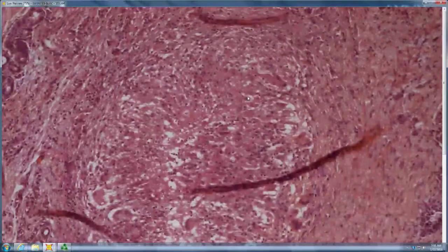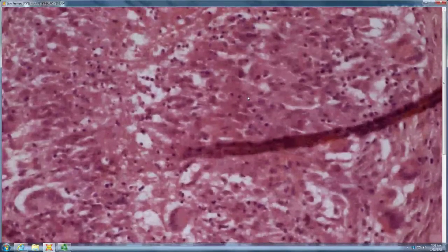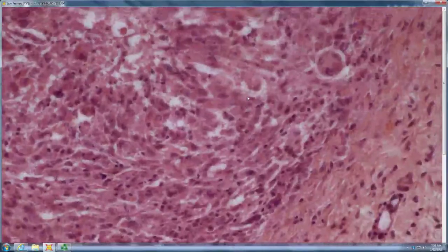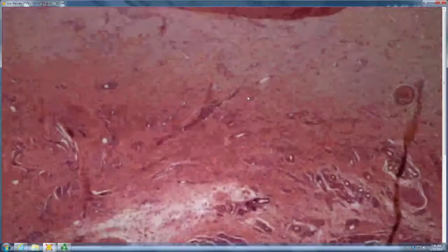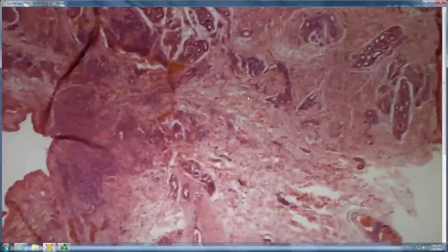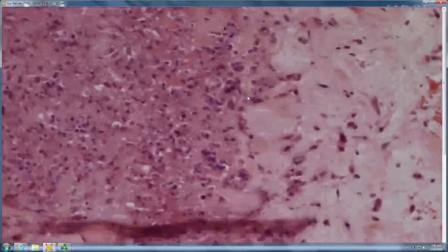Okay. So there are several giant cells down there. And let's see if we can find. You always look at an abscess or giant cells, that's where you're most likely to find organism. Let's try that. There we go. So abscess, even better than giant cell.